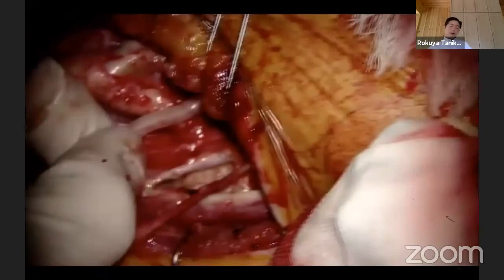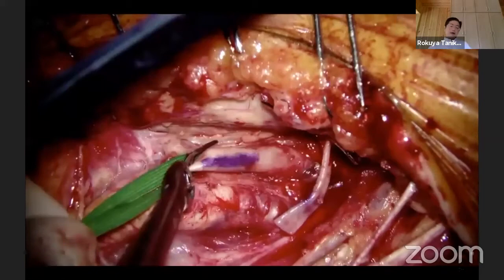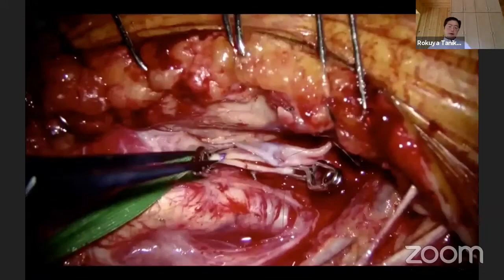After placing the graft, again the graft is expanded to remove any twisting or kinking. The external carotid has an arteriotomy with our punch.